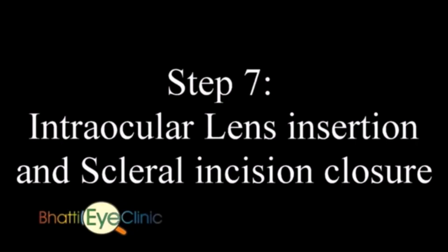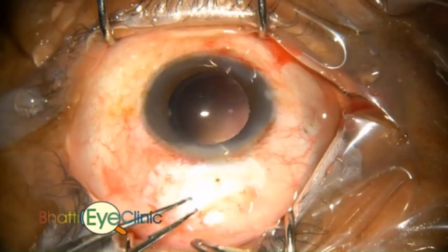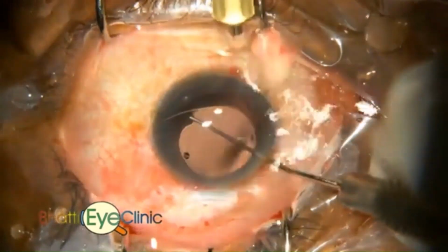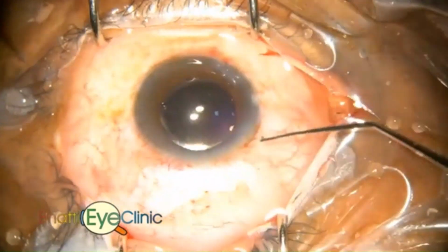Next, the anterior chamber is going to be reformed with viscoelastic, and a non-foldable one-piece IOL is inserted and dialed into position. That is the capsular bag. So that is the end of the surgery. That's how it looks.